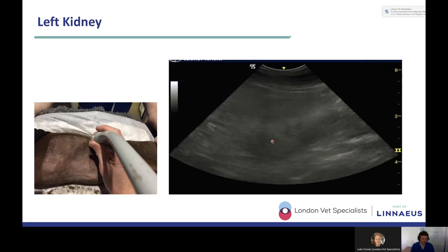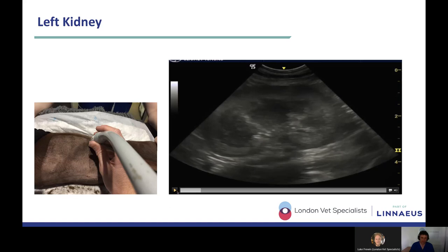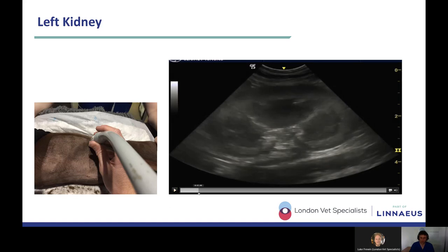Okay, so let's start with the left kidney. When we are starting our examination with the left kidney, the probe starts just caudal to the last rib, and you're very dorsal because that's essentially where the kidney is. So let's just play this video and see what the left kidney looks like. So this is me just having placed the probe onto the patient. We can see we've got a really nice sagittal view of this left kidney, and immediately it's looking nice and normal. So it's kidney shaped, it's got nice smooth margins, it's got a bright cortex, it's got a dark medulla, it's got beautiful corticomedullary definition.